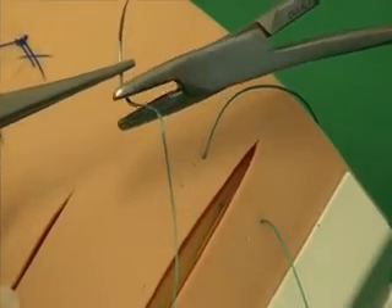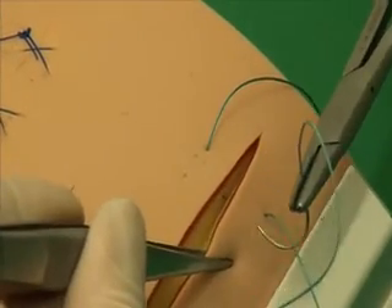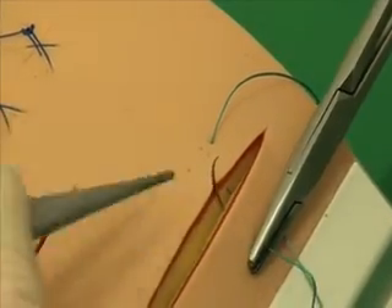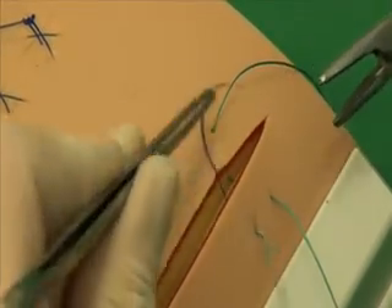To create a horizontal mattress suture, the needle is then turned and inserted on the same side of the wound, and guided parallel to the first part of the suture. It exits on the other side of the wound. The suture should not be placed too close to the wound edge, and it should take even bites of tissue.